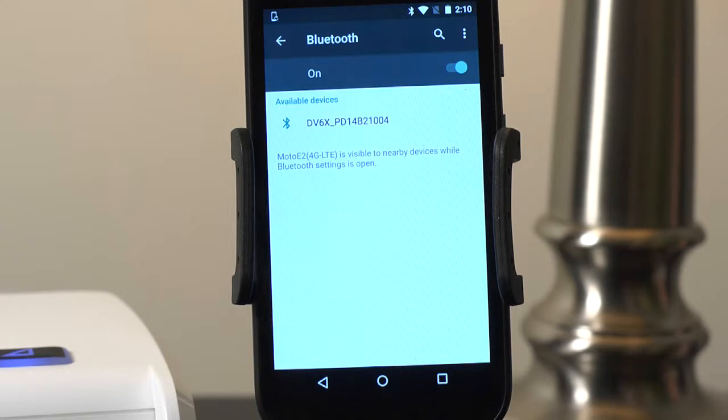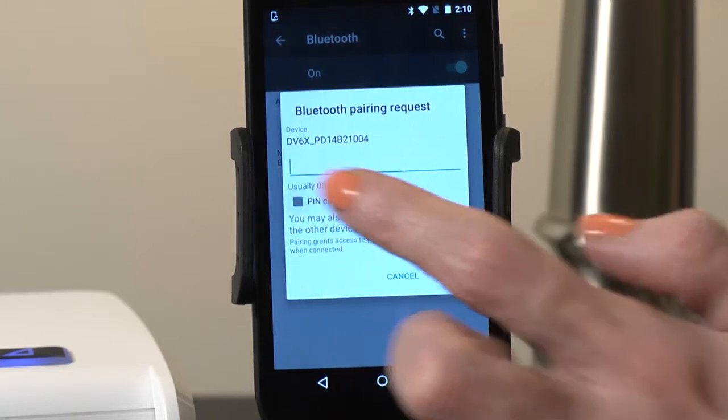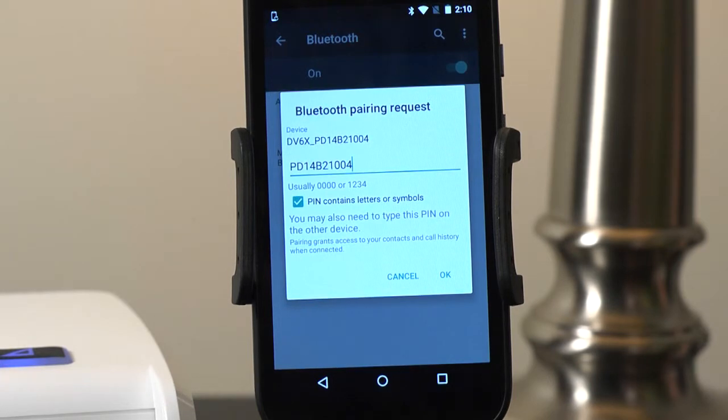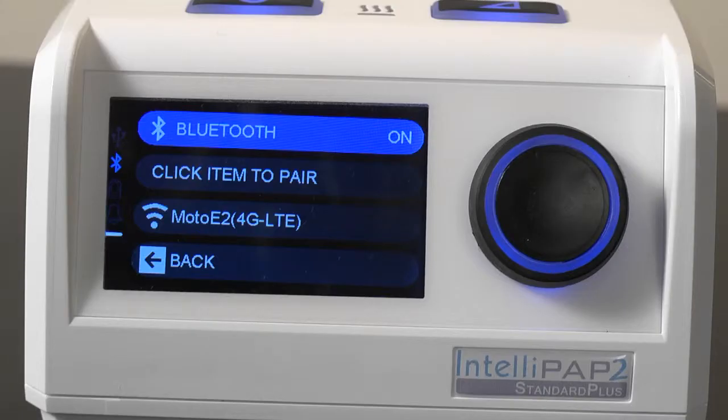Select the DV6X device to pair it with your Android device. You will be asked to enter a PIN number, which is your CPAP device's serial number. Ensure the box labeled PIN contains letter or symbols is checked. Tap the PIN number field and hold until Paste appears, then tap Paste to paste the PIN number and tap OK to connect.